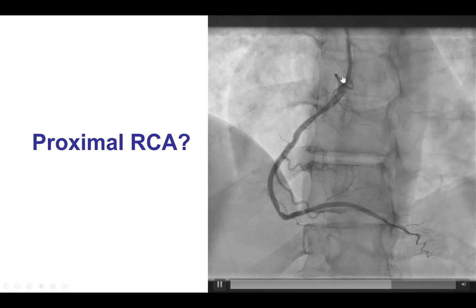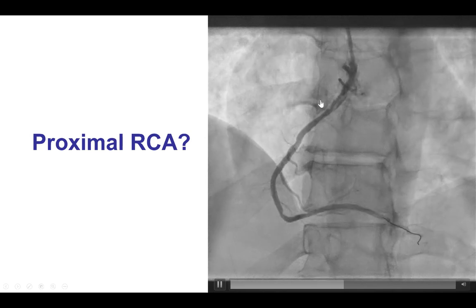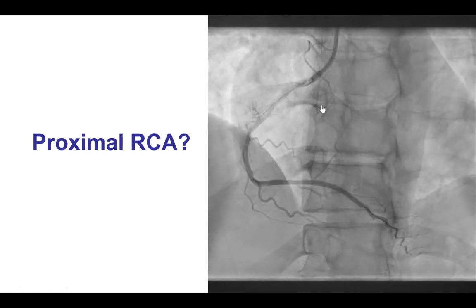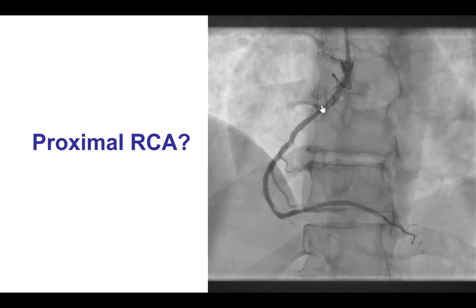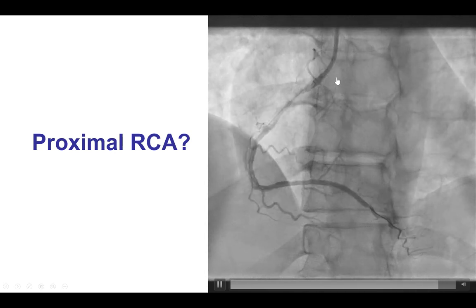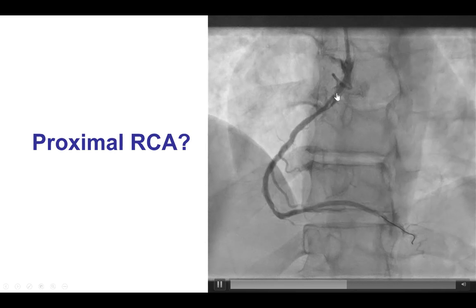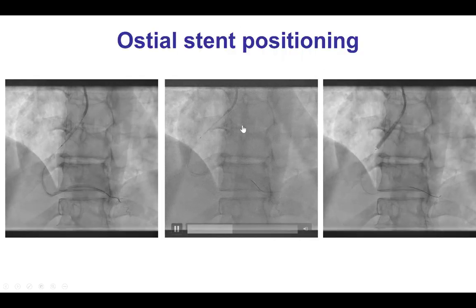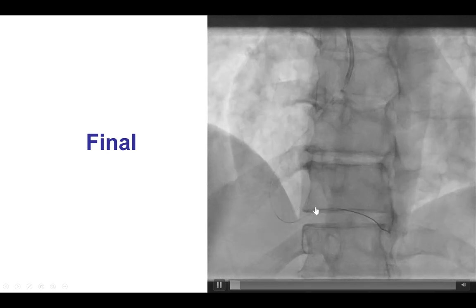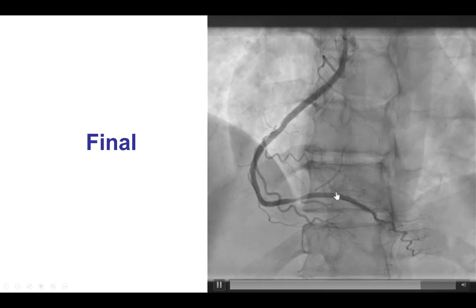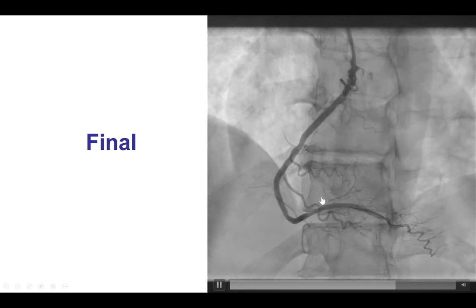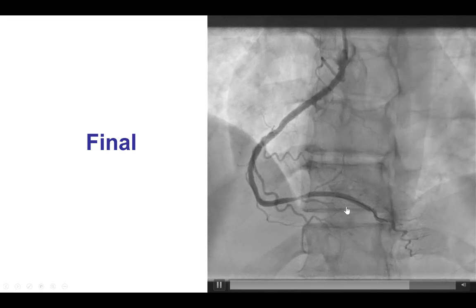However, engagement was challenging, and what we now have is a dissection of the proximal right coronary artery. This is potentially one of the reasons for preferring femoral access in patients with suspected spontaneous coronary artery dissection, because engagement may be easier in those patients, minimizing manipulations of the guide catheter and potentially preventing proximal dissections as happened in this patient. We had to put another stent in the proximal right coronary artery, and that provided a nice result. There was some area of lesion which could have been migration of the hematoma more proximally. We debated about whether to place an additional stent or use a cutting balloon to decompress it, but we decided to leave it as it did not appear to be compromising flow.